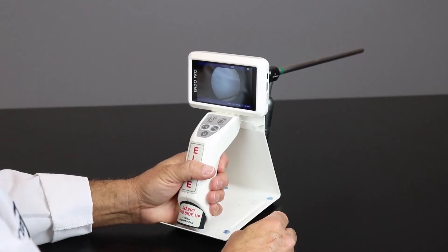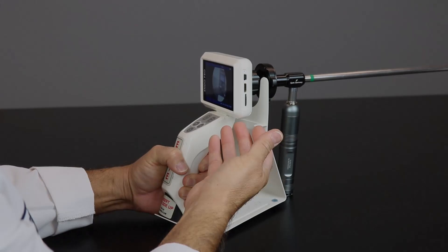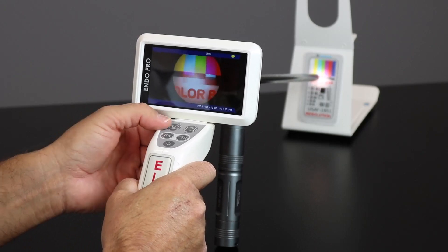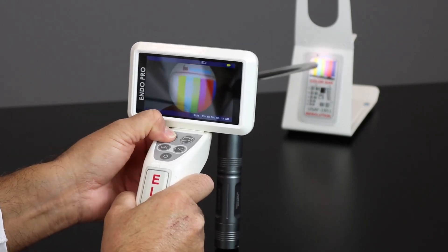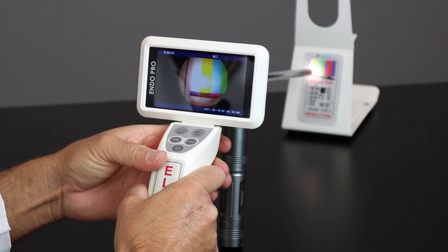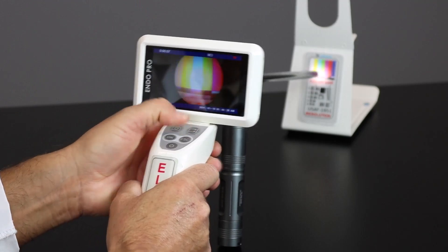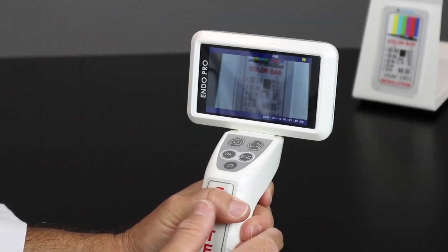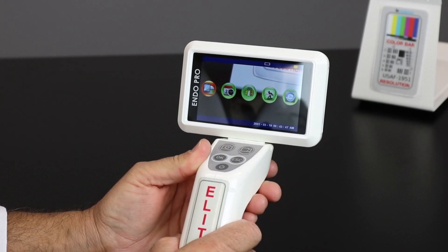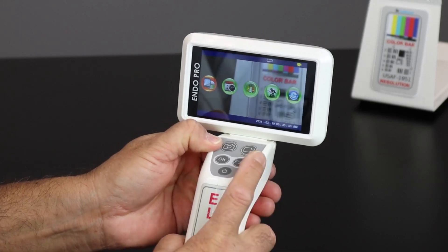Let's dive a little bit more into the functionality of the EndoProCam. The first step is you're going to take your SD card and insert it just like this. Now with the SD card inserted, you're ready to take pictures and video. Simply click on the picture icon to take a picture. To take a video, simply click the icon for video camera and you can see here it's starting to record. All you have to do to stop it is to click the same icon again. To access the menu for the EndoProCam, simply select OK. This will bring up the settings within the unit and you can toggle between left and right by using the icon for capture and video.